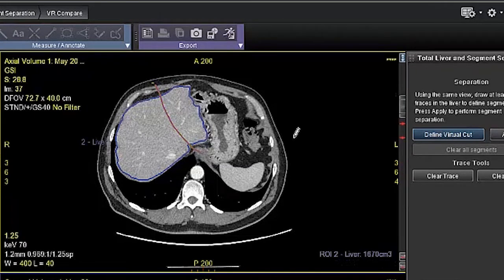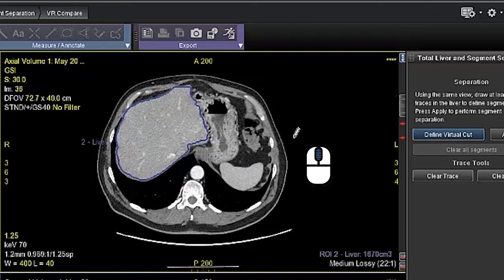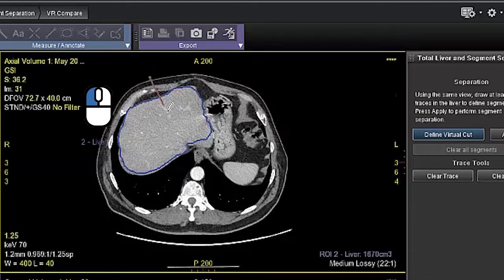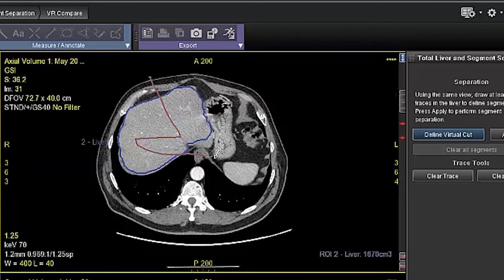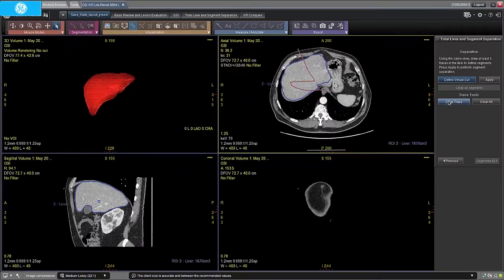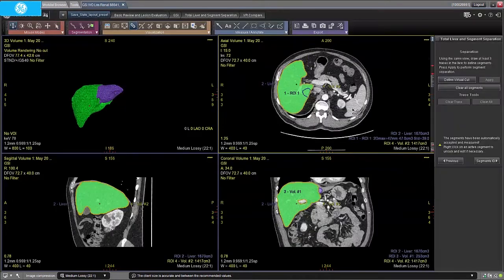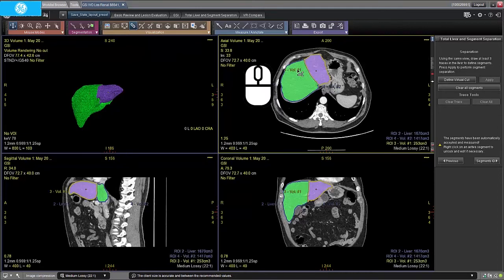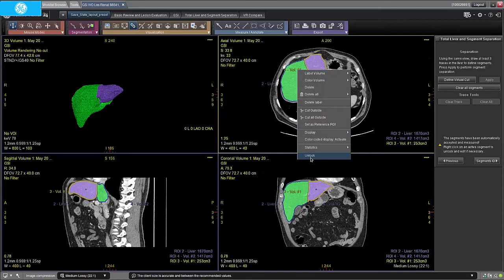Remember that the software needs at least three traces, but we can add more if we want to enhance results. Clear Trace and Clear All will assist the user in trace editing. To perform the segment separation, press Apply. Review the segment separation. If you wish to edit, right click over an active yellow segment and select Unlock.